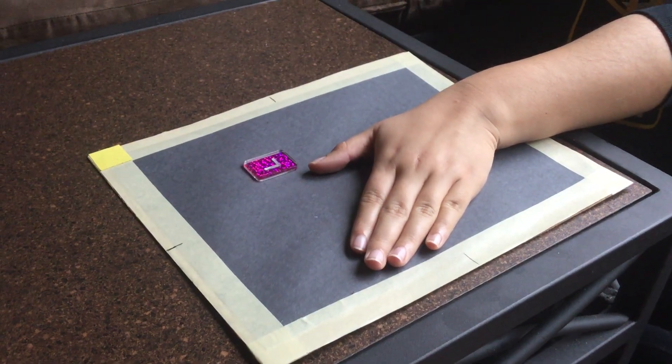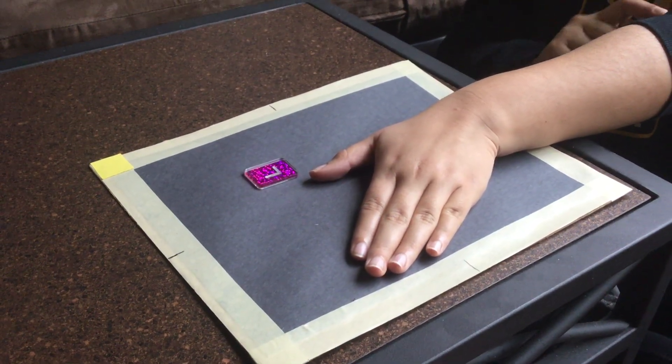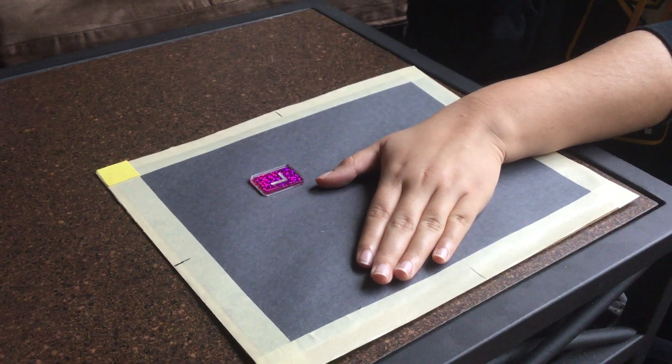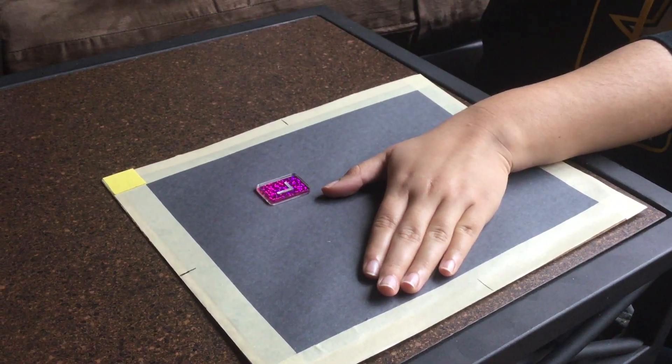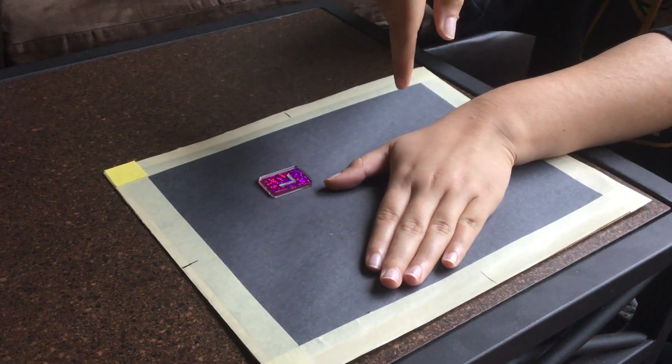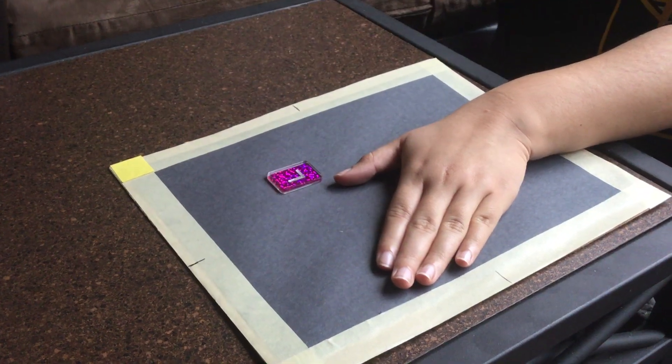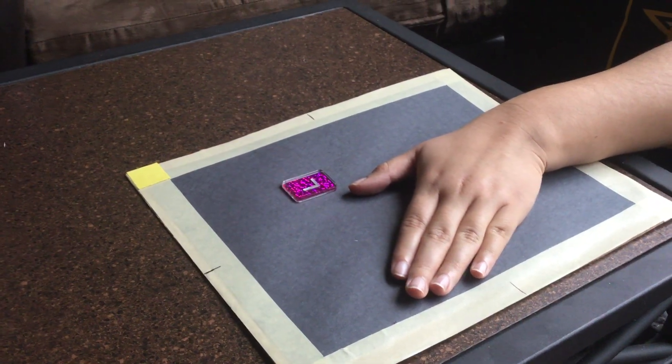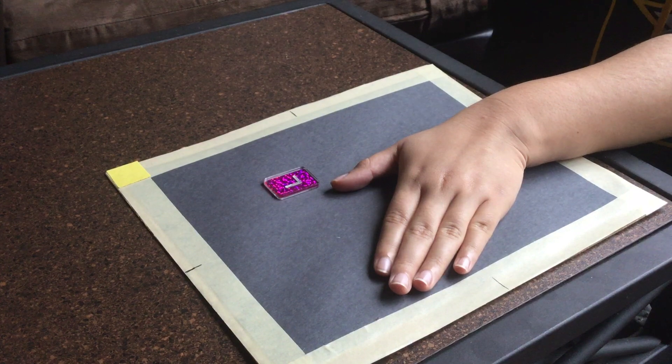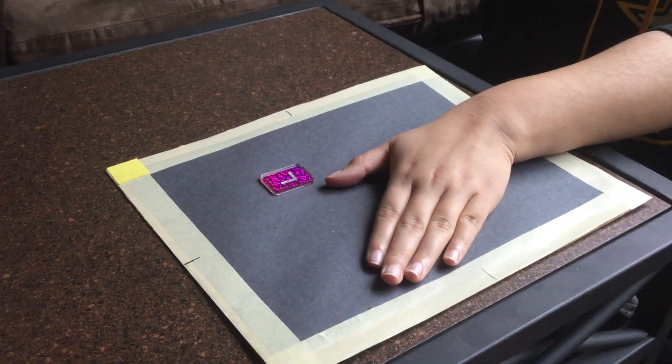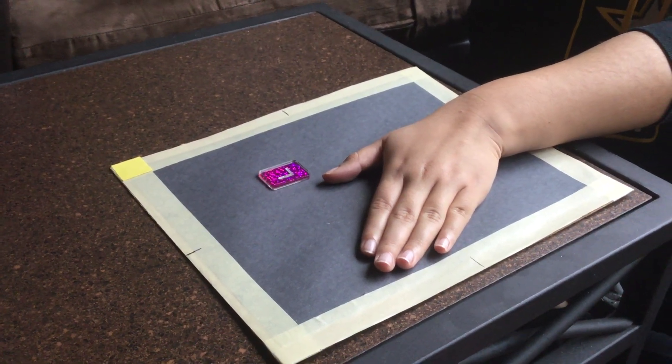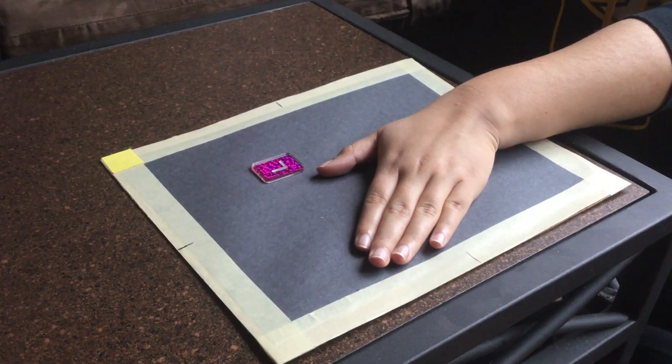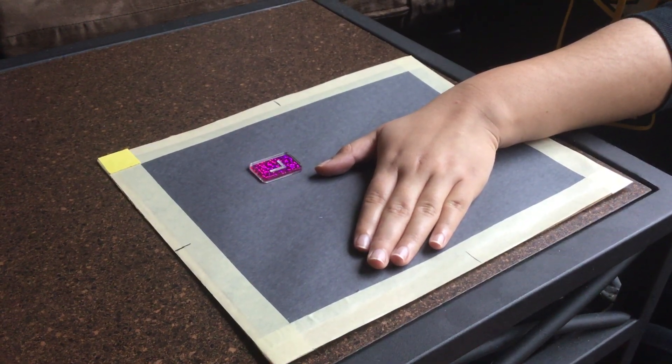The central ray is going to go through the first metacarpophalangeal joint, and we're going to collimate around the first metacarpophalangeal joint and the proximal and distal phalanges and articulations.